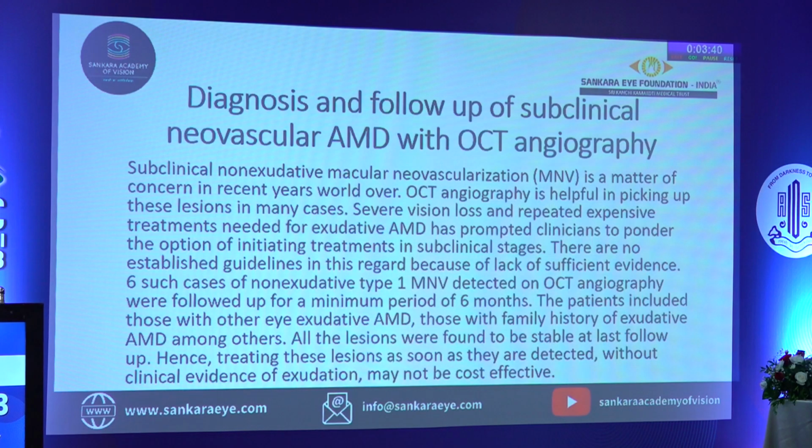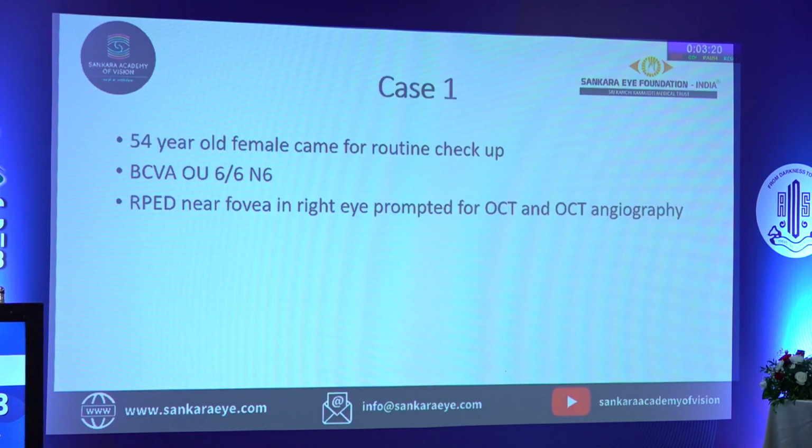My study is an observational prospective study. I followed up patients where, when I examined them clinically and found a subclinical CNVM, I followed them up for at least 6 months, and now I'm presenting my results. So I'm directly presenting the cases here.